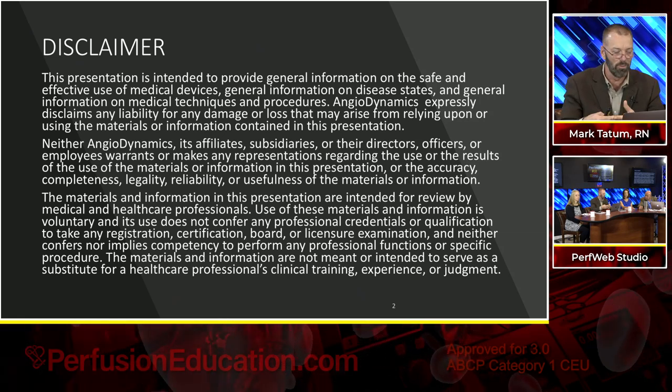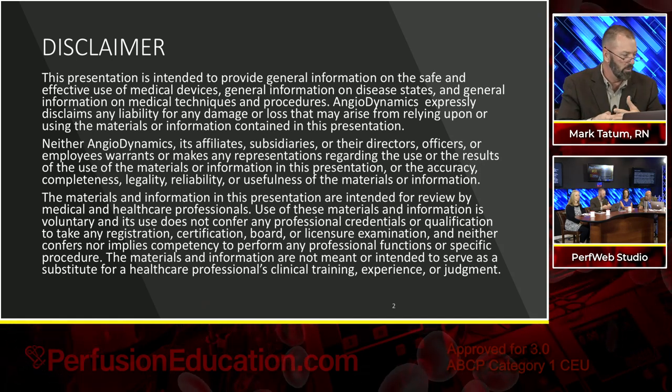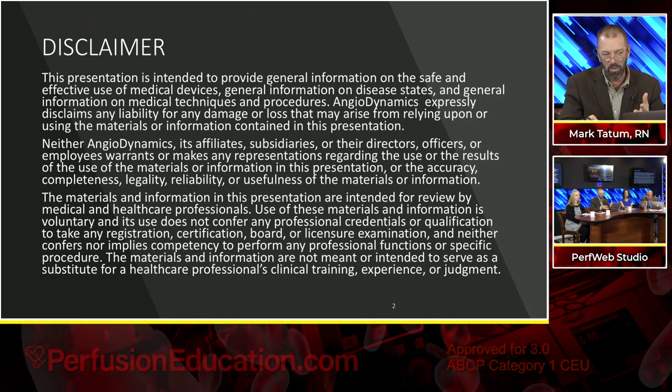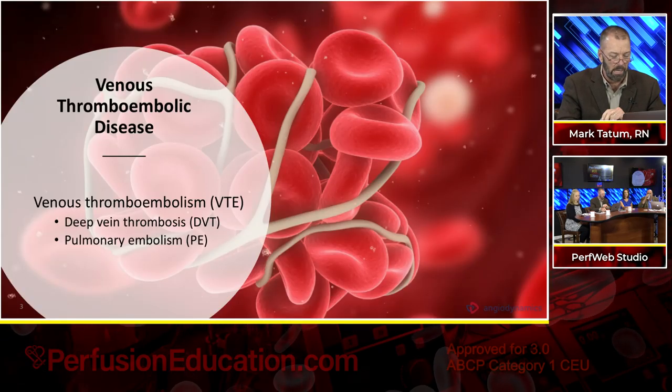You wouldn't be able to get it to do its job. So, because of our predicate device, that is what's on there. It is an understanding, however, that we are going to be working in areas of undesirable intravascular material or our newer indication, fresh or soft thrombi or emboli.